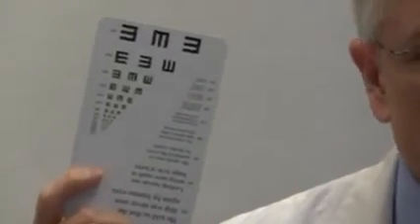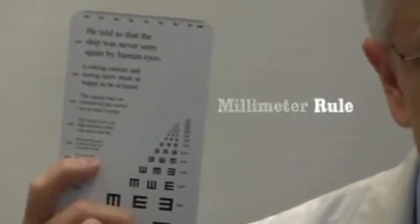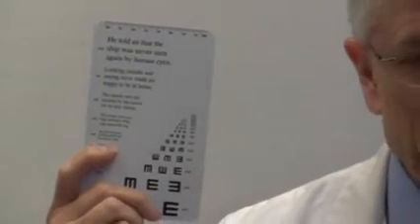And at one end of the card, there are these half-moon shaped objects that can be used for assessing pupil size. We're much better at comparing areas than we are at actually using a millimeter rule, which is on the other side of the card. This millimeter rule can be used for measuring interpupillary distances, or PDs, interpalpebral fissure distances, and corneal diameters.